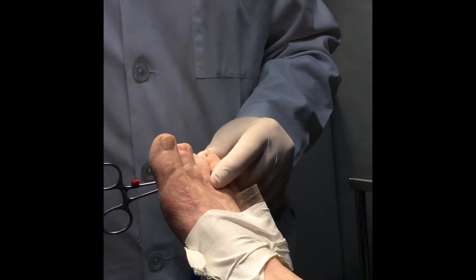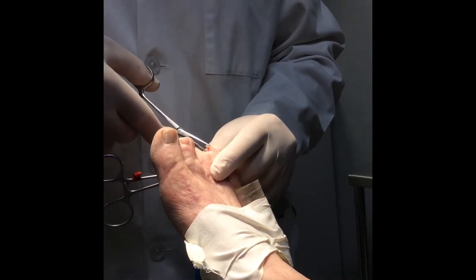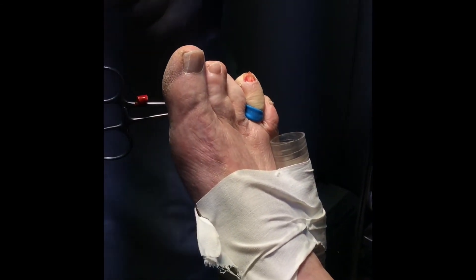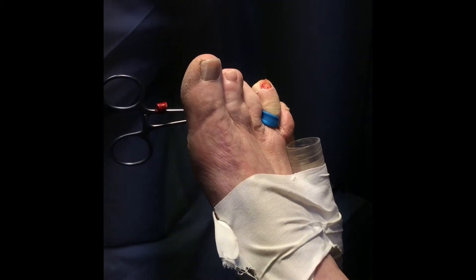There we are actually exposing the matrix. Okay, let's go.